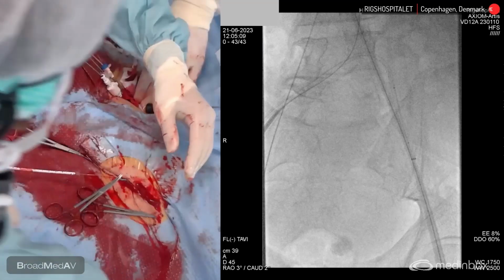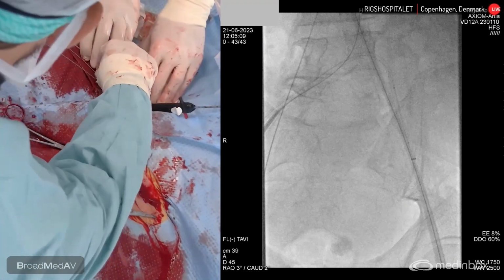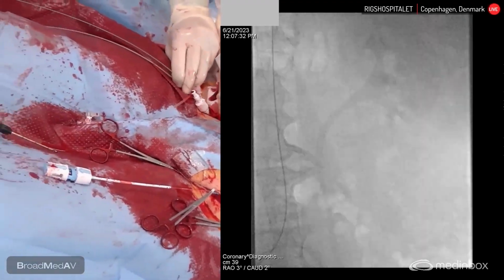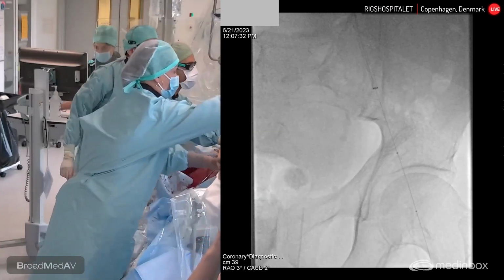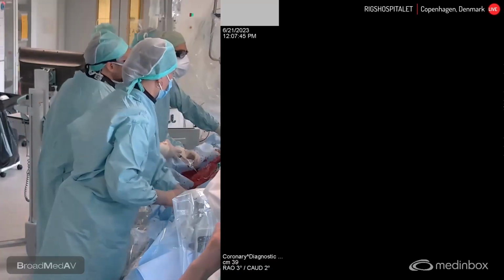Okay, put the crocodile on. Put the balloon now in place, please. Shuffle the balloon down in the position you have to do. Yeah, we do that. You raise the table. Maybe we're on a really low level, or maybe it's not needed. Yeah, okay, good. You can put it down. Yeah, you inflate there. Yeah, perfect. Inflate it.